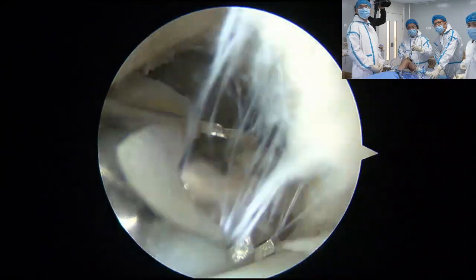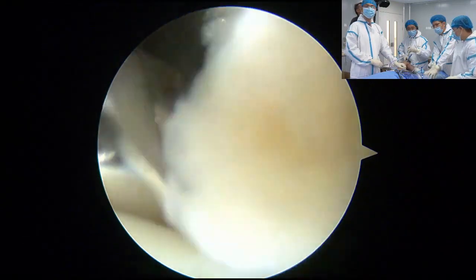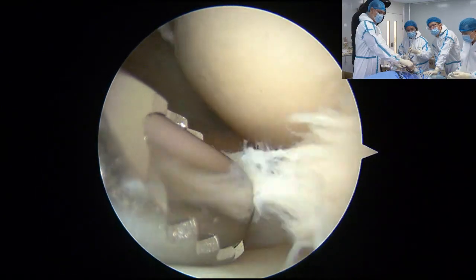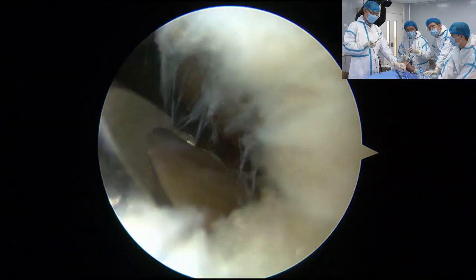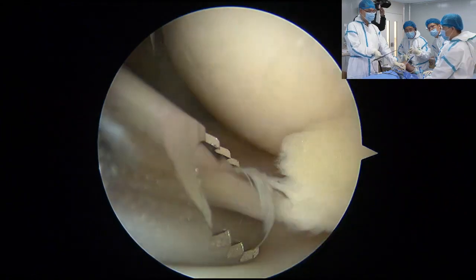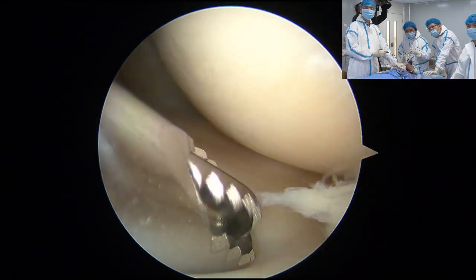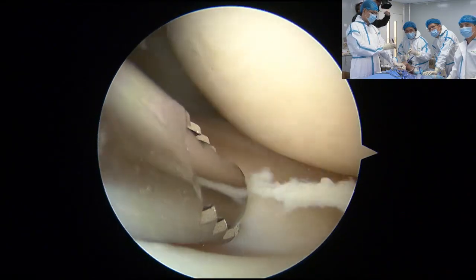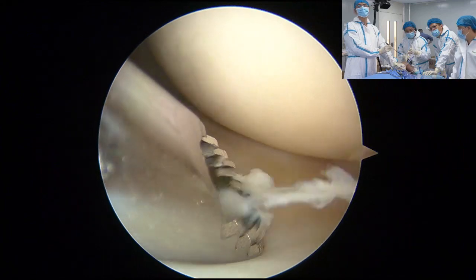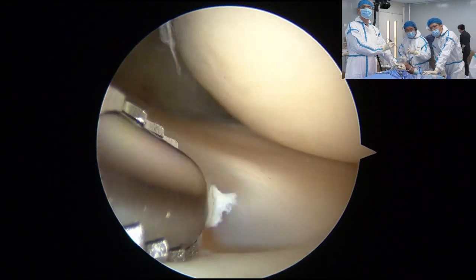So we go to the figure 4 position, cleaning some soft tissues. There's always a lot of fat tissue in front of the meniscus. First you need to have good exposure, remove some fat tissue, careful of the cartilage. 那做半月板手术的话，本身应该会有一些软组织和脂肪挡住视野，所以要清理一下。但清理的过程呢，也要保护软骨。Okay, now you expose the meniscus.